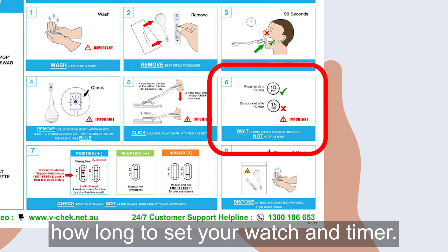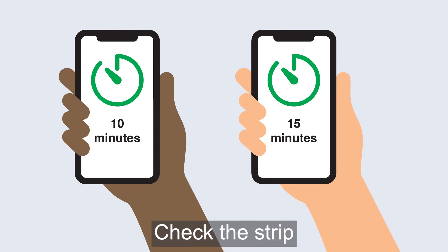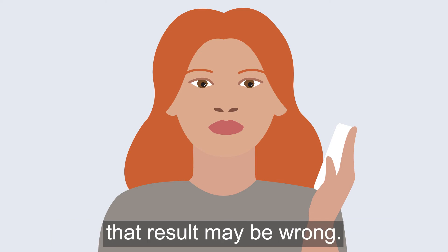Check the instructions that come with the test to see how long to set your watch or timer. Most tests take 10 or 15 minutes. Check the strip after the time to see what it says. If you wait too long to check the strip, the result may be wrong.